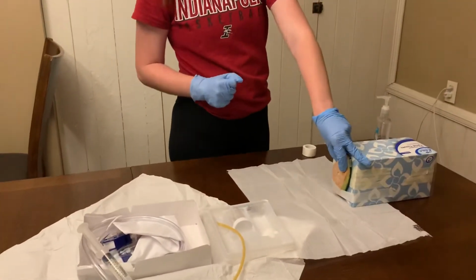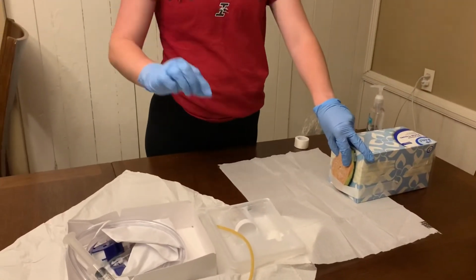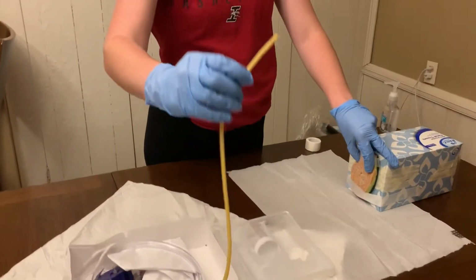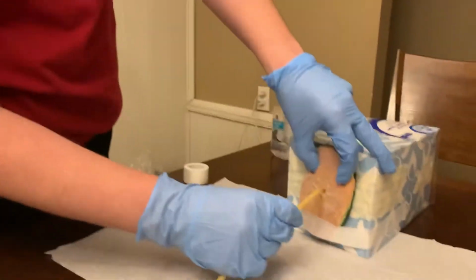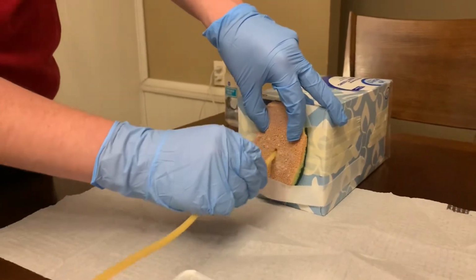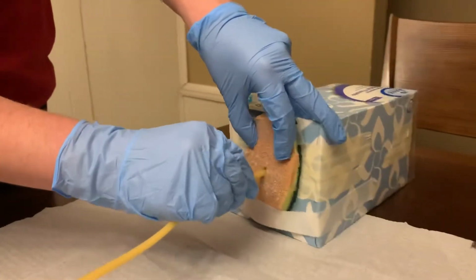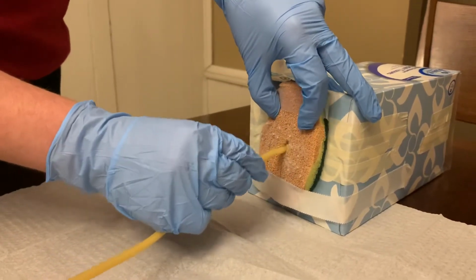Now that the perineal area is clean, I'll take my sterile hand and grab my catheter tip 2 to 3 inches from the tip itself. I will ask my patient to take a deep breath, and then I will just insert that catheter. Getting a little bit of resistance from my box.